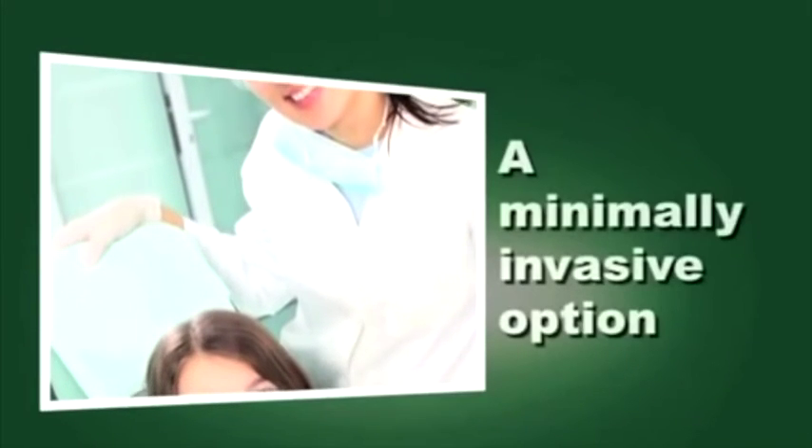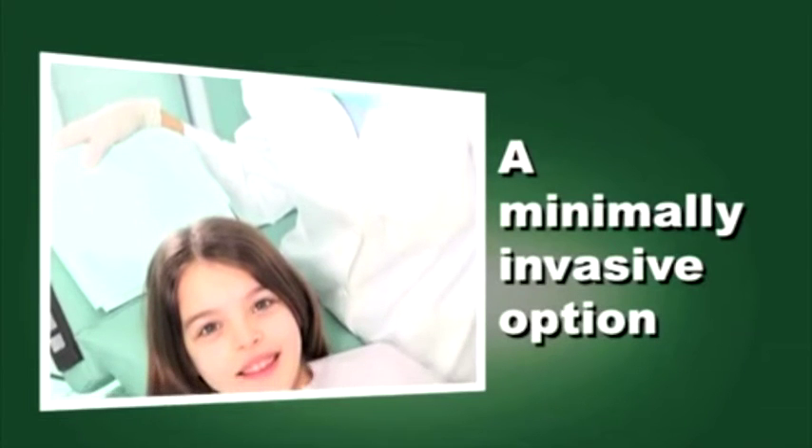Smart Burst 2 are effective caries removal instruments for dentists who wish to offer their patients a minimally invasive option for caries removal.